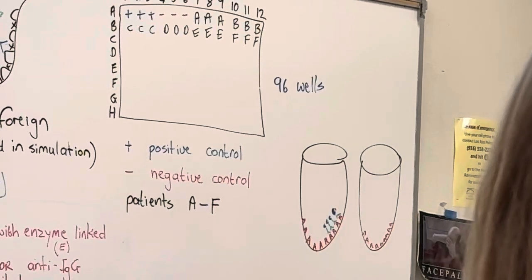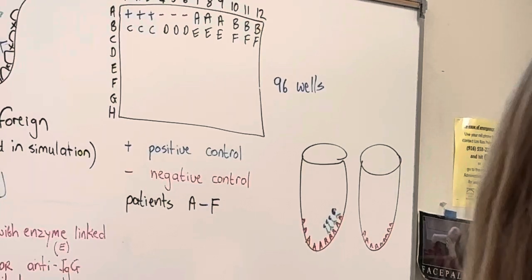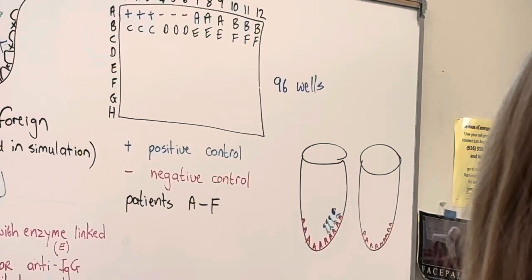Is the enzyme reduced because of that? The enzyme takes the substrate, so the Pac-Man takes the substrate, takes the chromogen, and changes the structure of the chromogen so that it'll change colors. Like the Pac-Man eats the chromogen, and because the Pac-Man eats the chromogen, it changes the color of the chromogen. That's how the chromogen works.